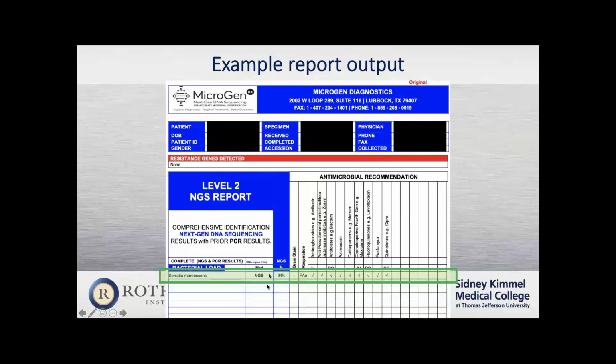And I'd just like to highlight that often this doesn't add up to 100% because it's a proportion of all of the classifiable reads present, and there's a read threshold and also a species detection threshold, perhaps 1%, that's used for clinical reporting.